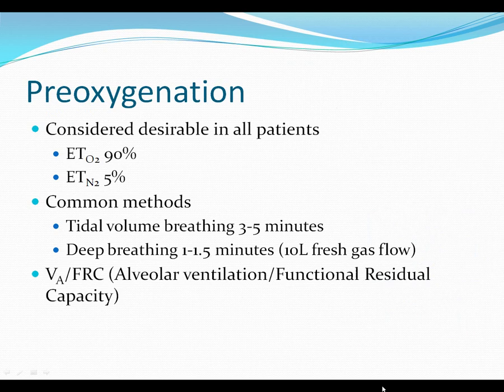All right, pre-oxygenation. It's something you do almost intuitively, but there's people have studied it. And there's a certain way to do it optimally. Pretty much consider it desirable in all patients. So how do you know when you have pre-oxygenated the patient? End-tidal oxygen of 90% or better, or end-tidal nitrogen, if you could measure end-tidal nitrogen.